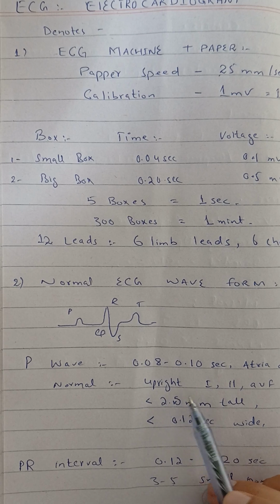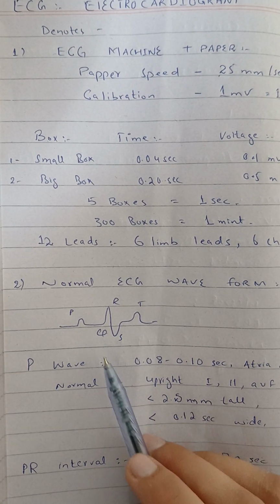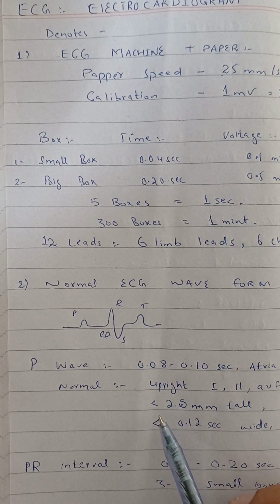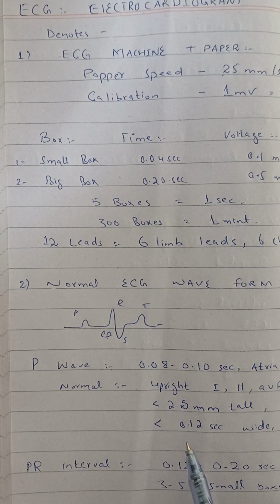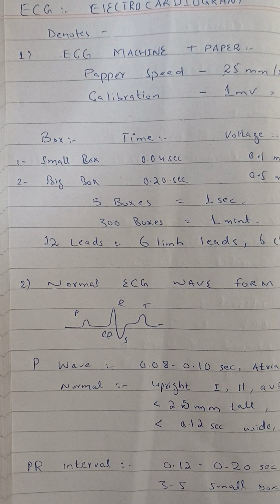Normally it will be upward in lead 1, 2 and AVF. It will be less than 2.5 millimeter, and its width will be 0.12 seconds.